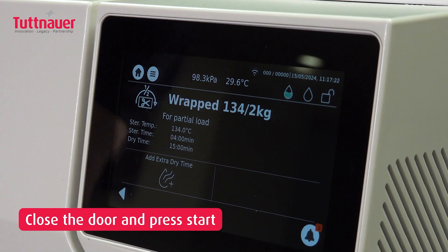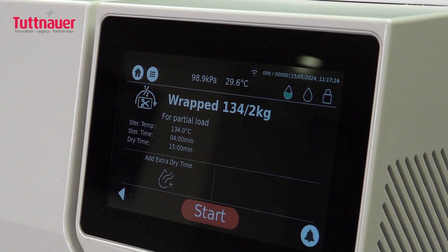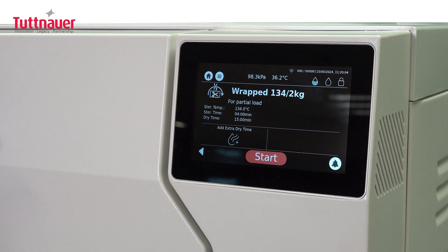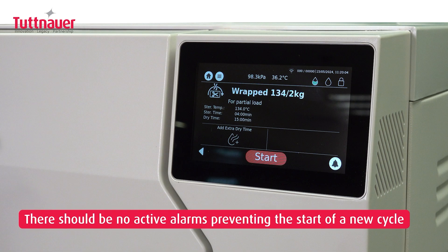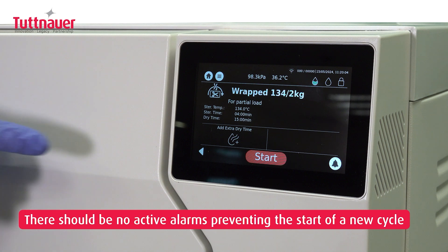Close the door securely and press the Start button. The Start button will appear on the touchscreen display only when all pre-start conditions are met: the door must be securely closed, the clean water tank needs to have sufficient water, and there should be no active alarms preventing the start of a new cycle.